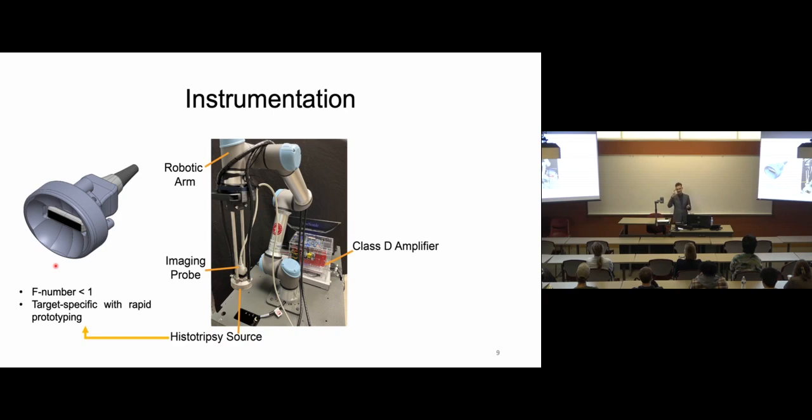The diameter, the geometry of the source, the size of the focal lobe, the output is sufficient to contain bubble activity within the iliofemoral vasculature of the patient. This is even fast enough that, while you could develop a source that would work in general, given sufficient imaging and input on the geometry and vasculature of the patient, you could design patient-specific sources, if you had a patient that was overly obese or particularly petite. So the first thing here is that we're developing a source that's much more focused and very specific to pathology.